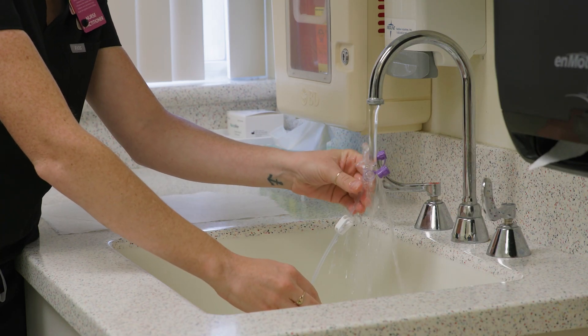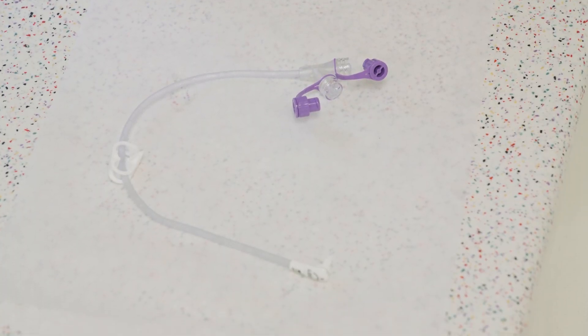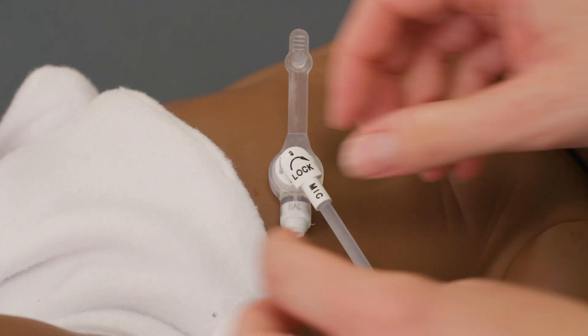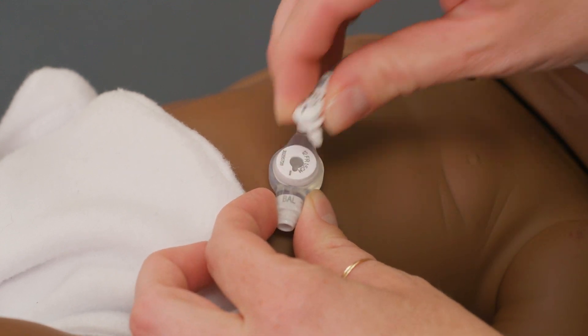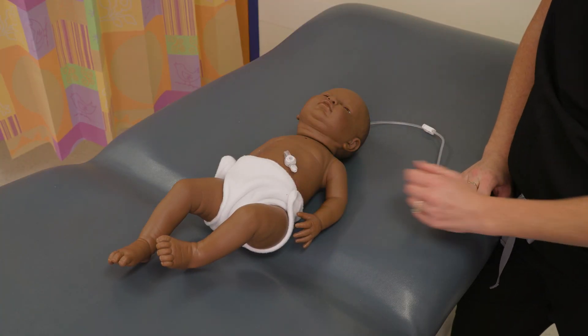Disconnect and clean the extension tubing with warm water when not in use. Leave the ports open so that it can thoroughly dry. It is important to disconnect the extension tubing when not using the feeding tube so that the tubing does not pull or accidentally dislodge the gastrostomy tube.